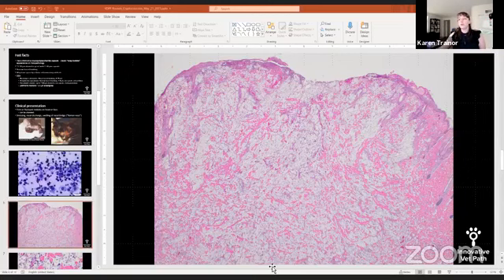And so most of the inflammation that we're seeing is mostly histiocytic. There are a few neutrophils here and there. Sometimes you'll see lymphocytes and plasma cells. But this is pretty classic for how it presents. And again, you can see at the low mag, if we come back to that, it's a somewhat nodular appearing lesion. And in this case, it is partially ulcerated. We've got some erosion as well, and then some development of crust on the surface, some exudate. That is fairly common with this presentation.